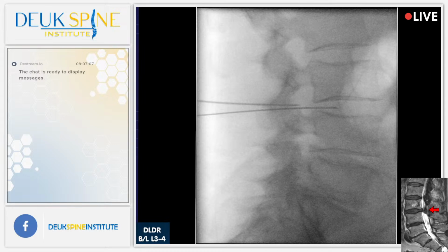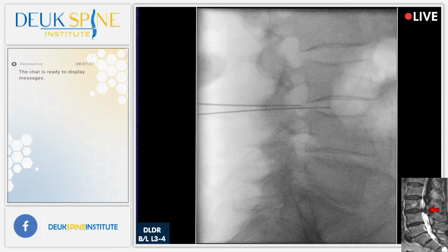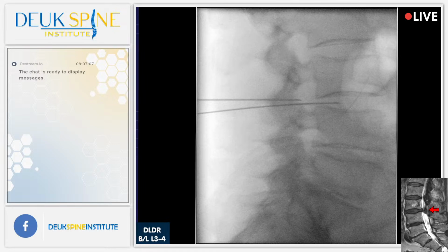All right. No pain down your leg right now, right? No. Where do you have that pain right there? Where's your pain? What did he say? Where is the pain right there? Where is it? In your back or your leg? What's that? We can't hear you. Say it louder. Sean. No pain? Are you having any pain? You said no pain. I gotta have them more awake, honestly. Gotta work on that.